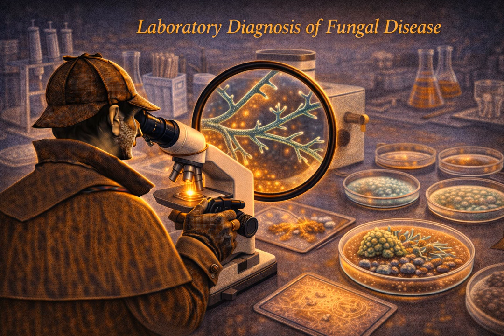So after the KOH does its work, the human cells dissolve into a clear soup, and the fungal hyphae are left behind completely intact and visible. It clears the fog so you can actually see the enemy. But Murray mentions a practical tip here. It takes time. It does take time.